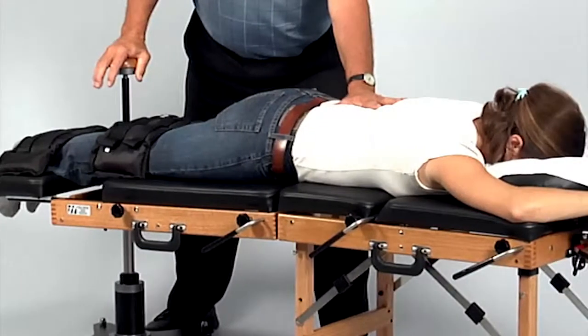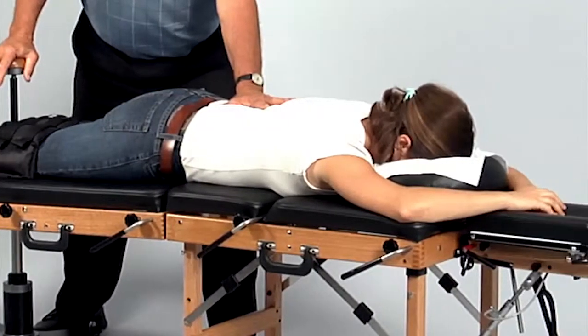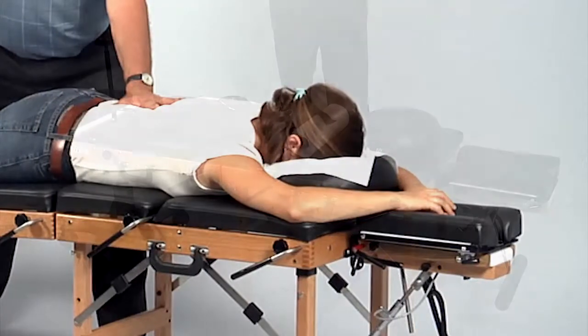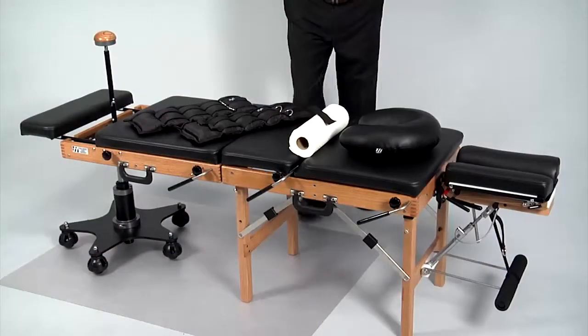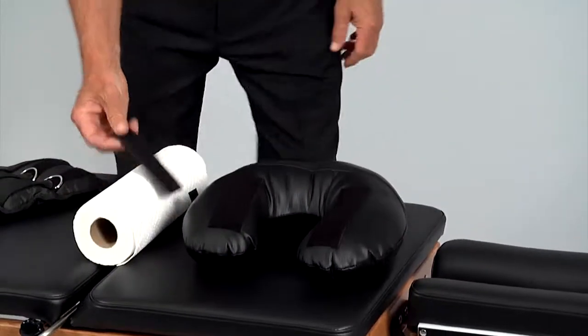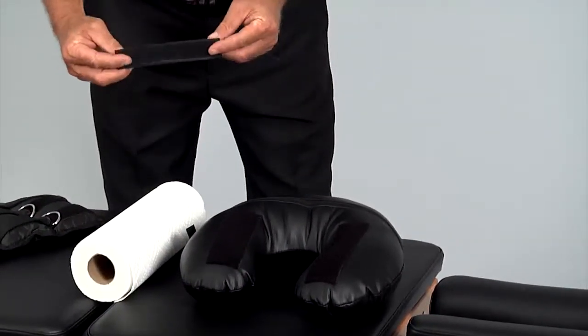Because your patient must be positioned lower on the table when using the flexion distraction device, his or her face will not be on the table's headpiece cushion. An accessory we recommend is the Thuli table's comfort pillow. Apply the velcro strap to the underside of the pillow to secure it into a position that is comfortable for your patient.